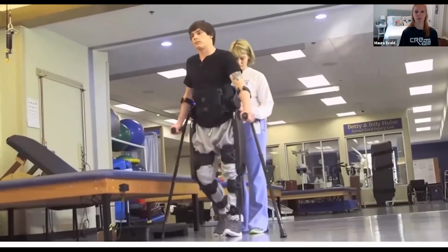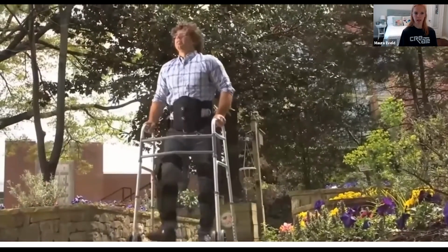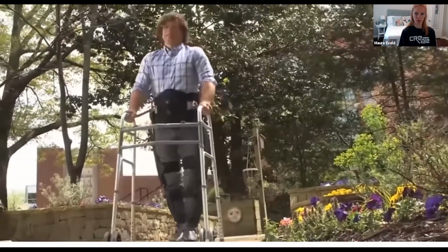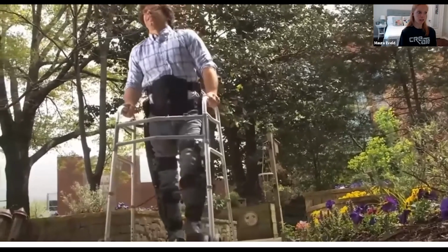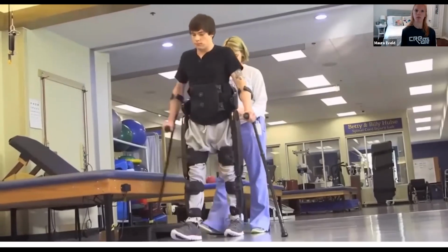Next, we have an example of a powered lower limb exoskeleton. So this device is intended for individuals with spinal cord injury, meaning that they are paralyzed from the waist down. The device can actually stand and walk for the user using motors at both of the hip joints and both of the knee joints.